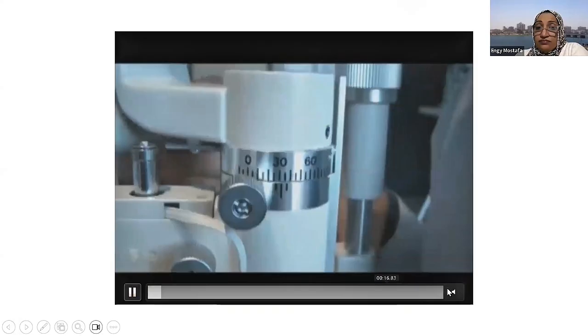What's the difference between the direct and the indirect retroillumination? Here, we use the iris as a background. We use the pupil as a background as well. So you put part of the illumination on the iris and part on the pupil. Here we go. Still, we are using 45 degrees between the illumination and the viewing system. We are focusing here, part on the iris and part on the pupil, so that we can check the cornea as well.